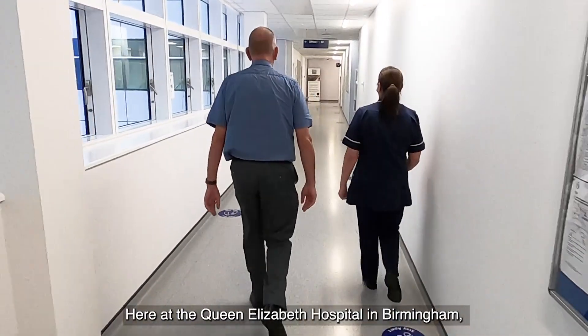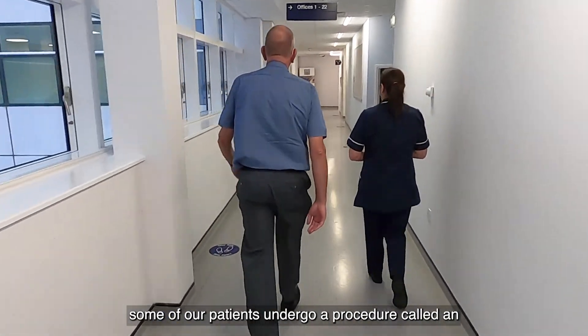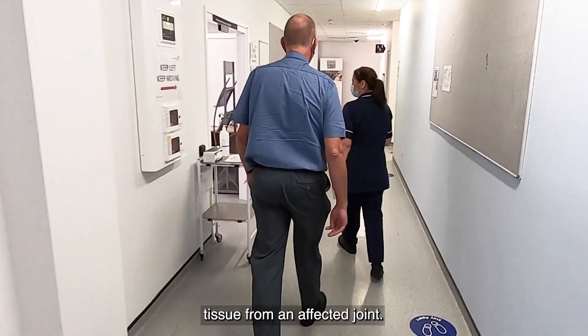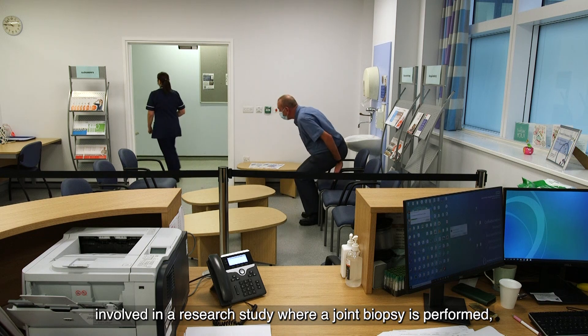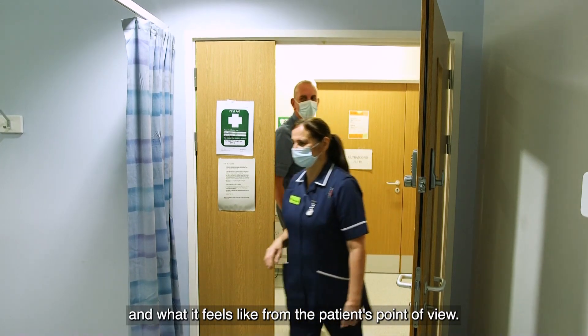Here at the Queen Elizabeth Hospital in Birmingham, some of our patients undergo a procedure called an ultrasound guided biopsy, taking a small amount of inflamed tissue from an affected joint. This video will explain what is involved in a research study where a joint biopsy is performed and what it feels like from the patient's point of view.